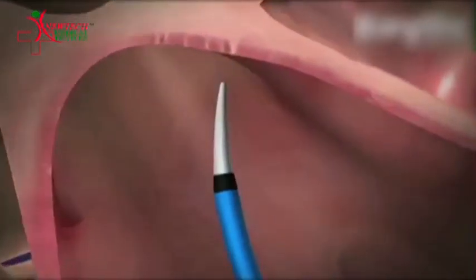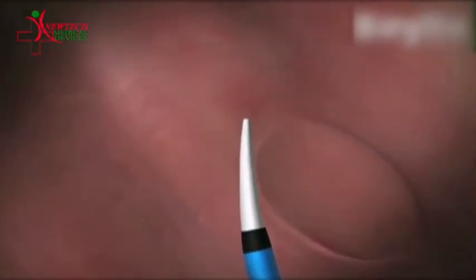The goal of transeptal catheterization is to cross from the right atrium to the left atrium through the fossa ovalis. Puncture of the fossa ovalis itself is safe.